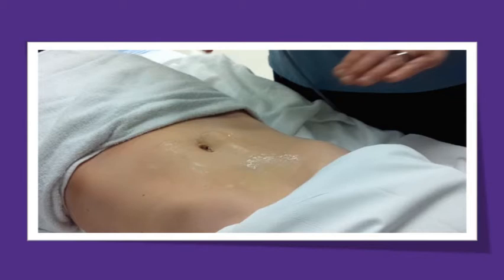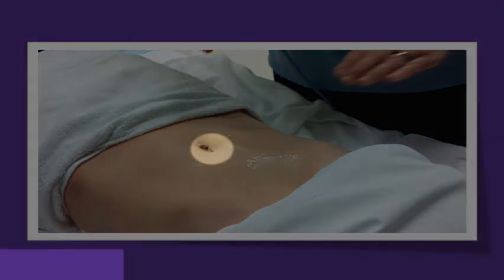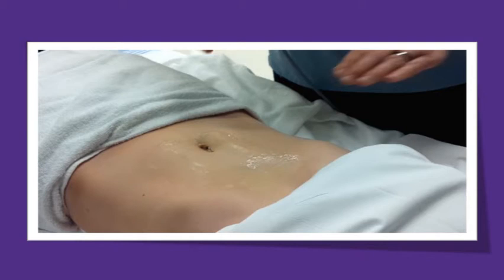The majority of aortas you will scan will bifurcate at or near the patient's umbilicus. The umbilicus is an air-filled structure, and as such, scatter may make your assessment difficult. We may also encounter foreign bodies, such as piercings, as we demonstrate in this model patient. One option is to fill the umbilicus with gel to remove the majority of the air pocket, although to be honest, this is not a technique I use frequently.